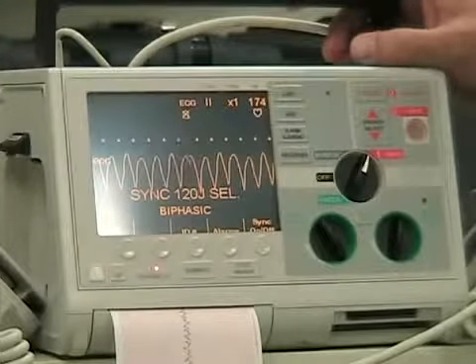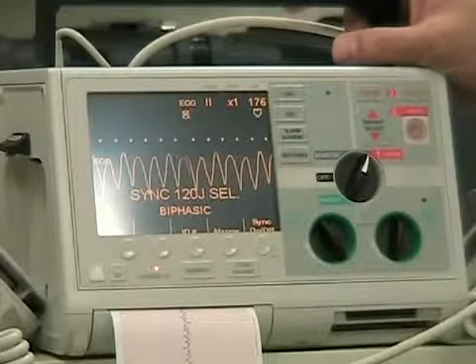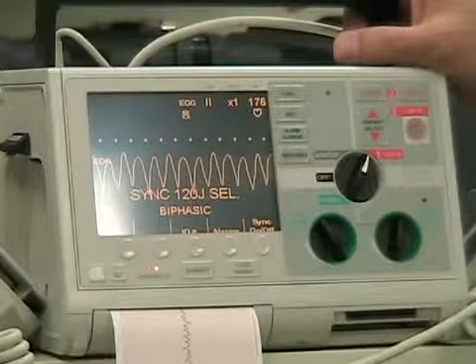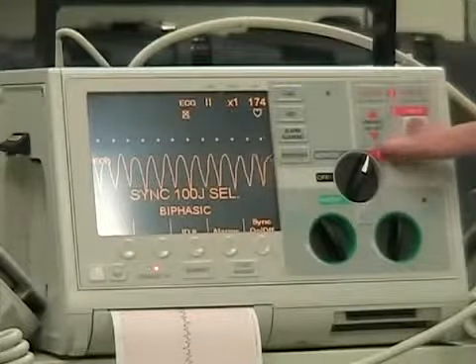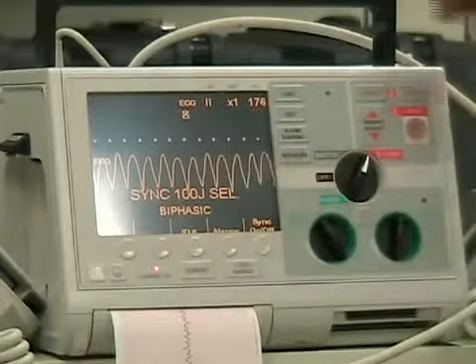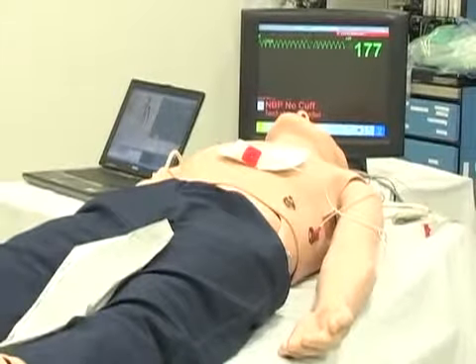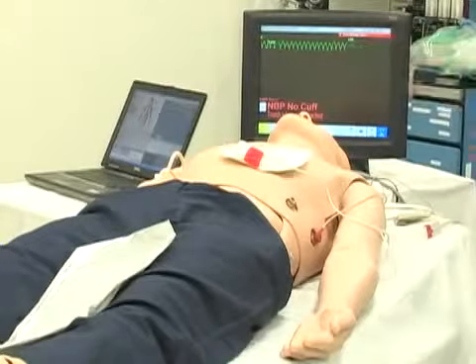Now, what is the correct setting for the synchronous cardioversion? One easy way to remember it is, whether it's monophasic or biphasic, 100 joules works for either one of those. So for synchronous, if you always remember 100 joules, you'll always be right. We are ready to discharge, and we discharge. And immediately after we discharge, we go in and start reassessing.